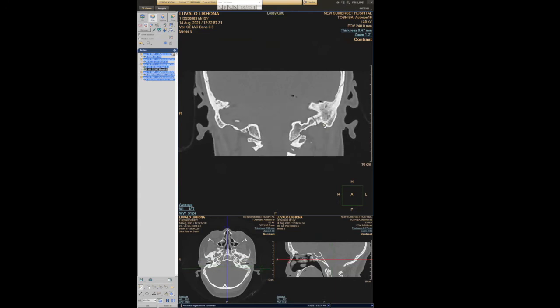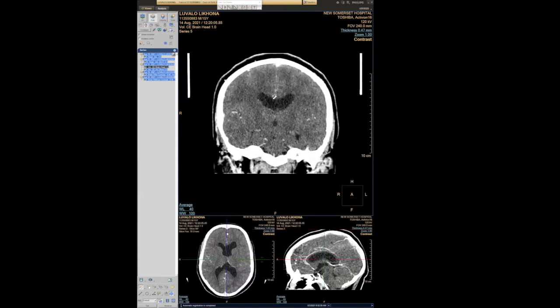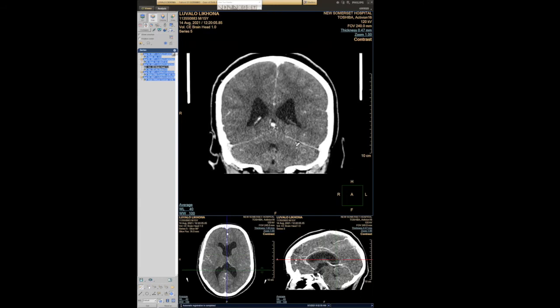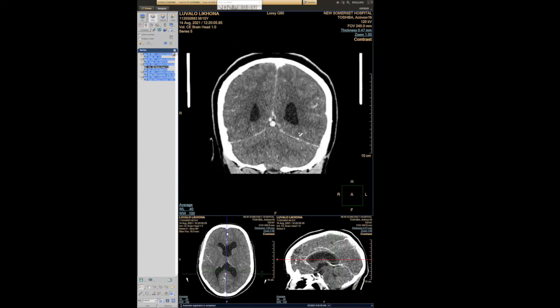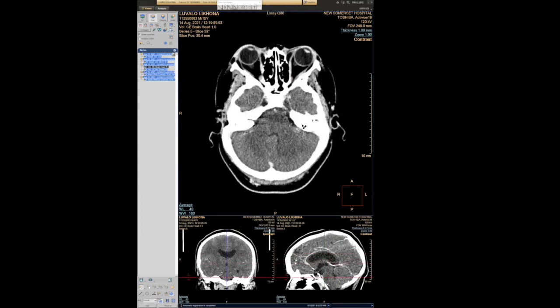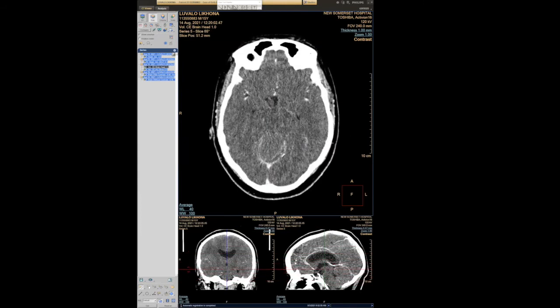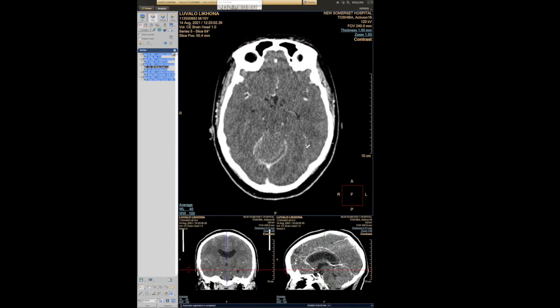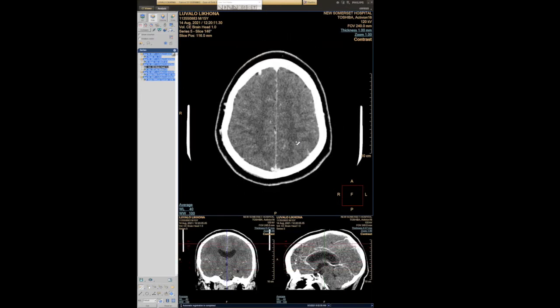We can also appreciate that there are intracranial free gas locules lining along the temporal bone and extending into the subtentorial space. On the contrast study, we can appreciate a sliver of subtentorial subdural collection that is associated with these gas locules. The collection, just a sliver, measures about 4 millimeters on axial plane, and it's starting to cross the midline to the contralateral side. Otherwise, there is also diffuse cerebral edema.